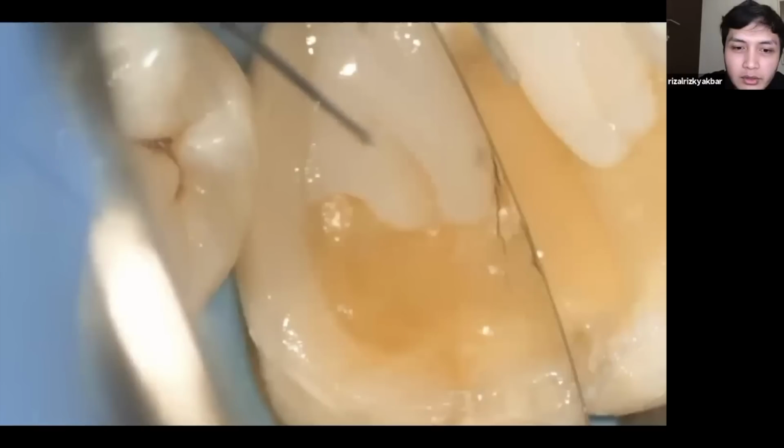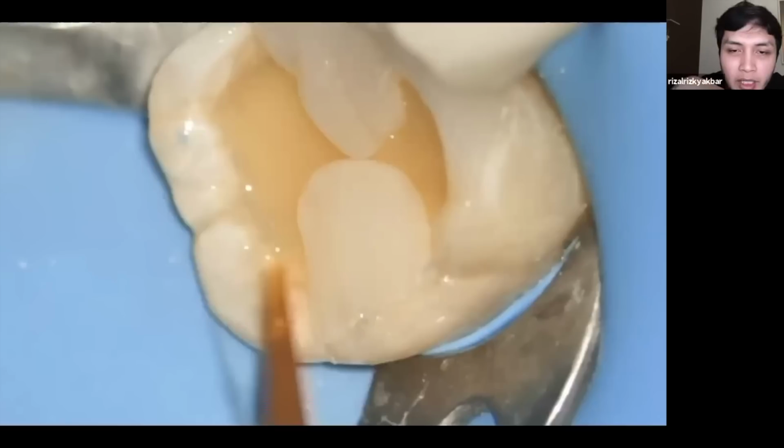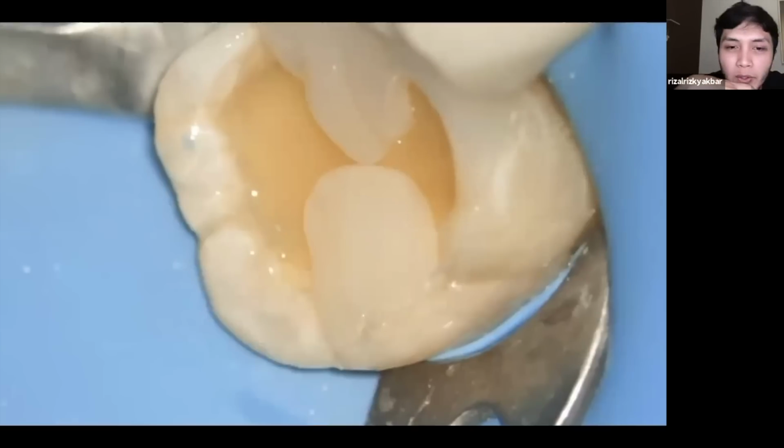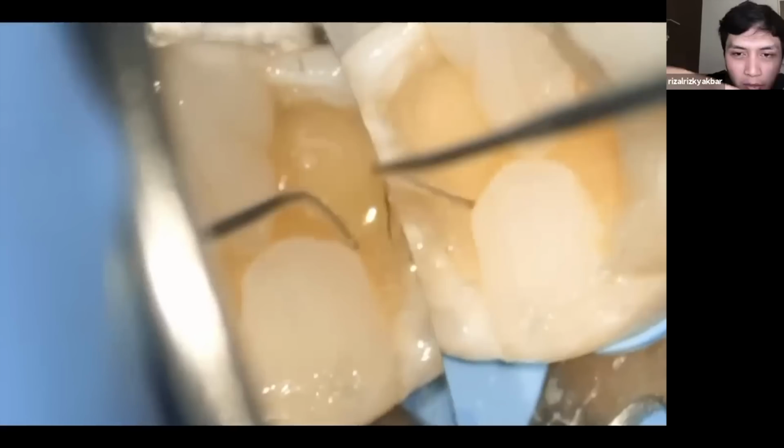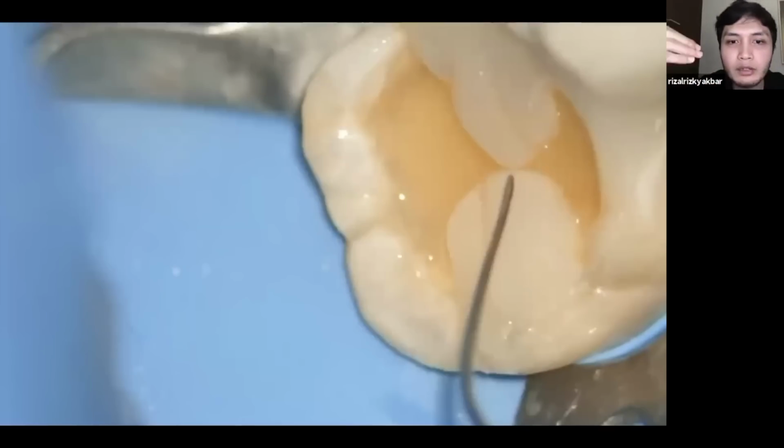So I always tell everyone that creating posterior anatomy is just like creating a separation, and then you push it gently and make it close to each other so that the separation will close and it will create the form that you want to create.